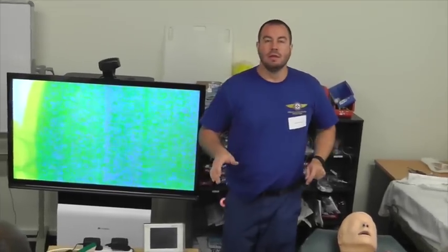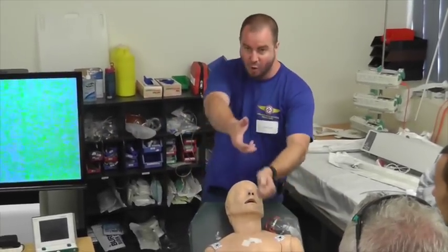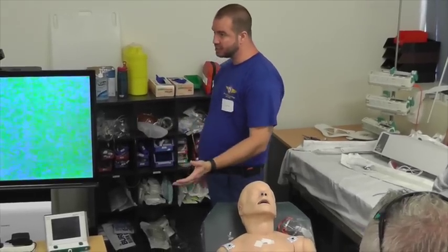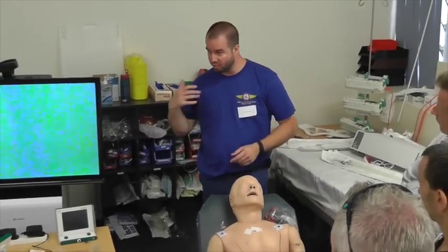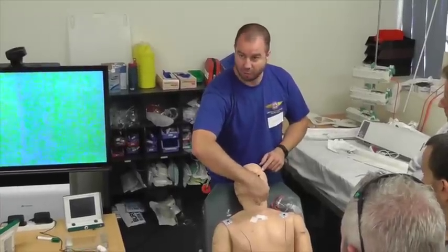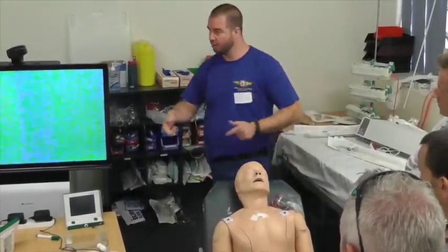Geoff, do you ever employ an assistant to do a jaw thrust or pull on the tongue? If they're not compliant, so I want them to go, stick your tongue forward when I'm getting the view of the cords. If they're not compliant or they don't follow directions, either because of sedation or refusal, generally you get an airway assistant to hold the jaw and pull it forward, or some green gauze if they're ketaminized, and you can pull the whole tongue forward.